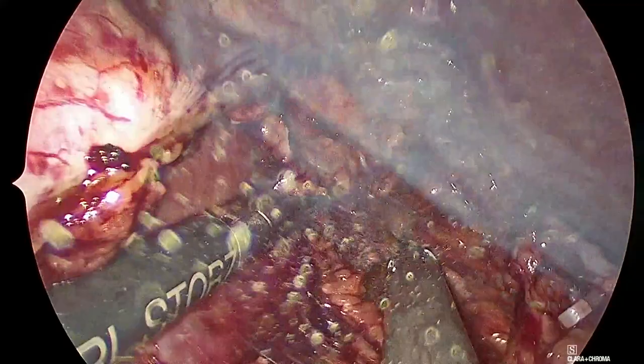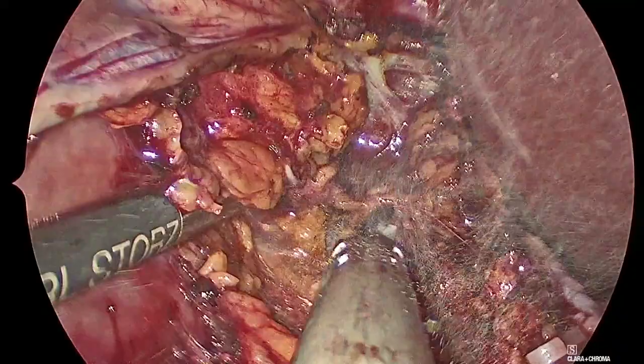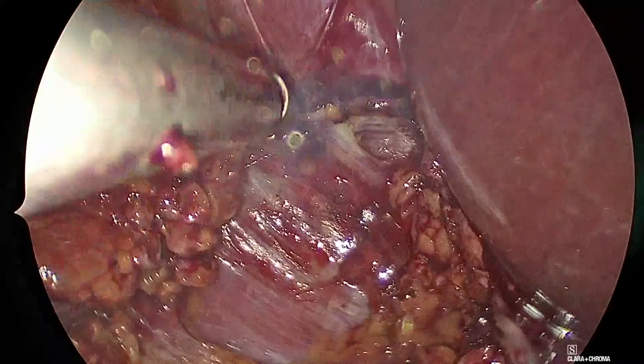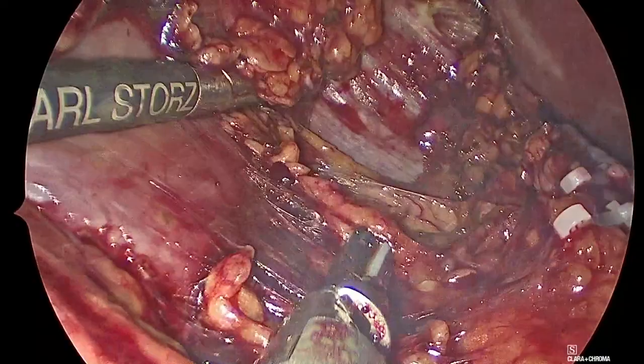And once we have all liberated, then it's becoming a safer surgery because all the upper part of the kidney is mobilized. So in case something bad happens, you don't have to worry about the IVC, you don't have to worry about anything other than place an endo-GIA in there and take the kidney out. Sometimes we forget that bad things can happen in kidney surgery. Okay, so now all the upper pole is mobilized, you see nicely here, and the adrenal gland, we didn't even see it, but we know that it's down there.